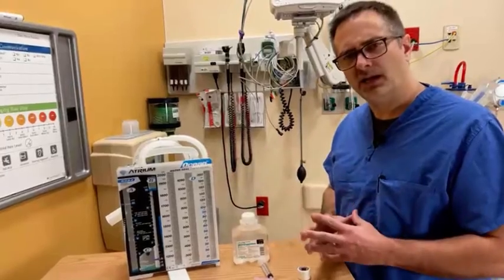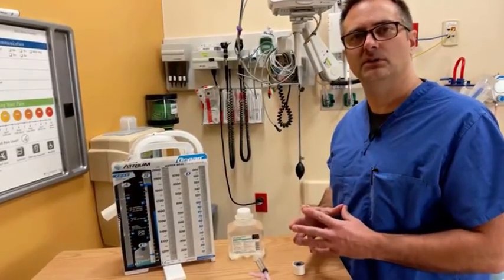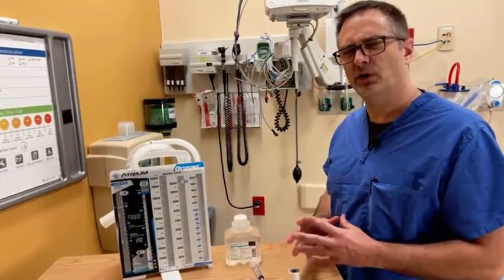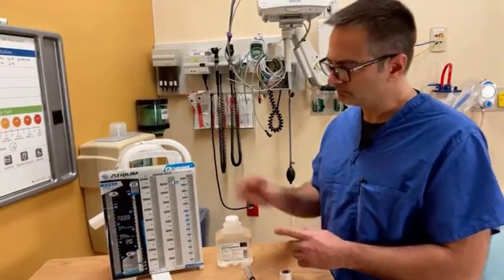Now, depending on your agency, excessive amounts of output could be important. It may indicate we need to go to the operating room to explore for possible ongoing bleeding. So follow your agency's protocols on the recommendations for appropriate amount of output.